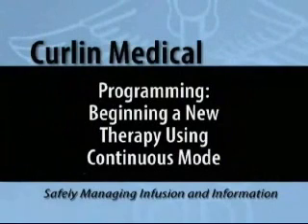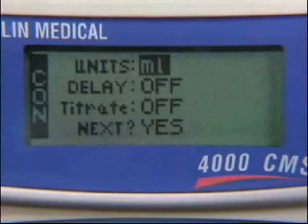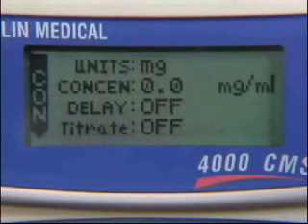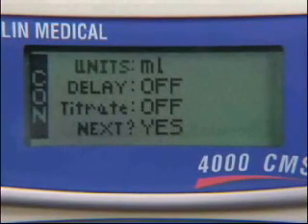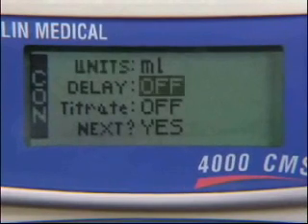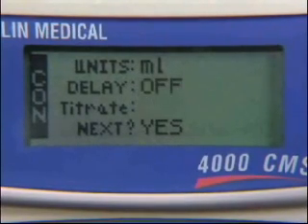If your pump has been set up to deliver continuous infusions — when administering some antibiotics, for example — this is how you would create a new program for continuous mode. With the Program line highlighted, press Yes Enter. Select the unit — ML will be flashing. If this is the desired unit, press the Yes Enter button. If not, press the No Change button to change the unit to MG or MCG. Once the desired unit is showing, press Yes Enter to advance in the menu. For this program we are going to use ML. Press the No Change button to add a delay time to the therapy, or press the Yes Enter button to accept the default delay, which is off.